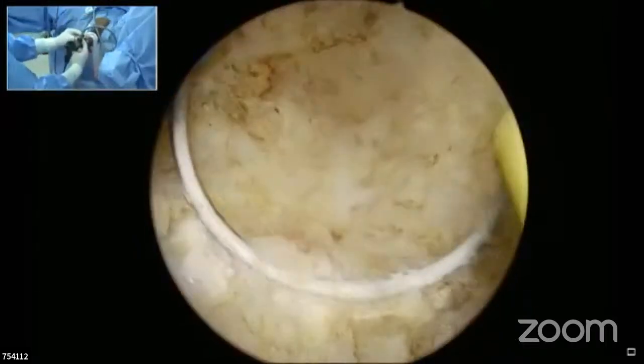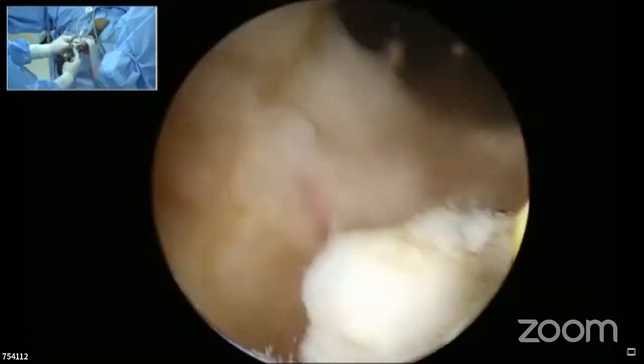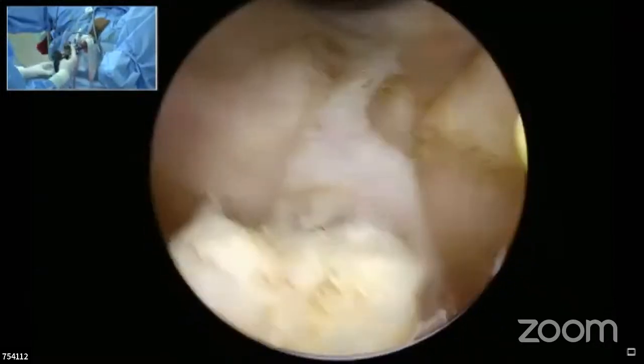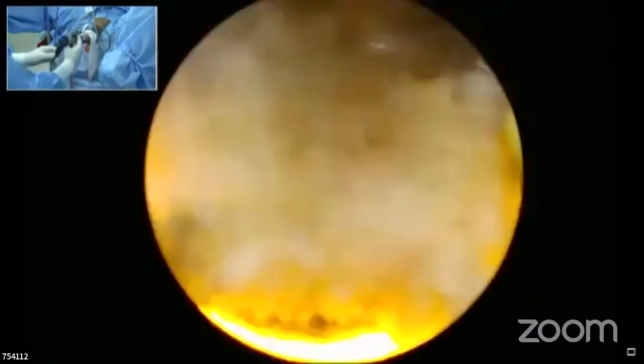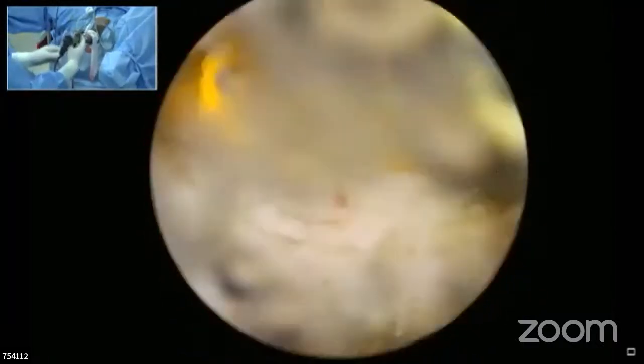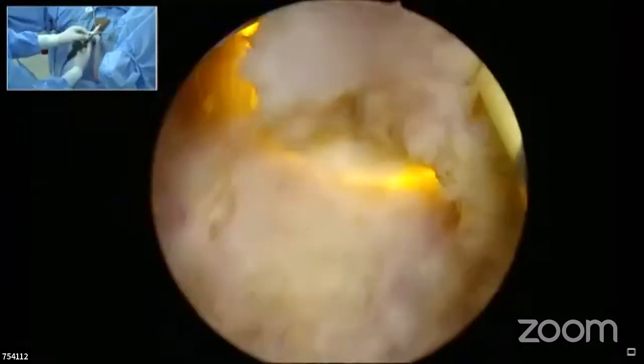I also do one thing I would like to add here. After doing the medial lobe, suppose it is very large, I will break and wash the bladder once and then come back and start, because these pieces are coming back to the prostatic fossa again. That was exactly on my mind, sir, because now these chips are falling back and troubling.